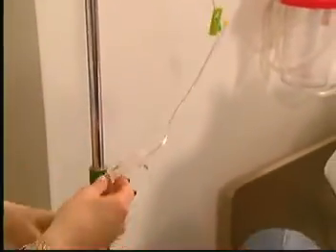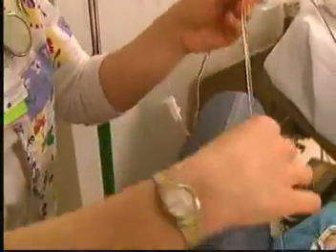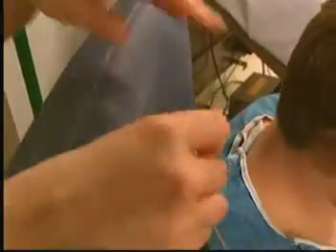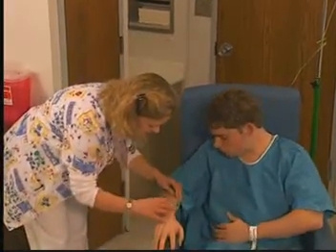Look for any kinks in the tubing. Kinks can easily develop if the patient lies on the tubing or if it becomes caught between a side rail. Be sure the entire length of the tubing is patent and intact. Take a little closer look at the site itself.